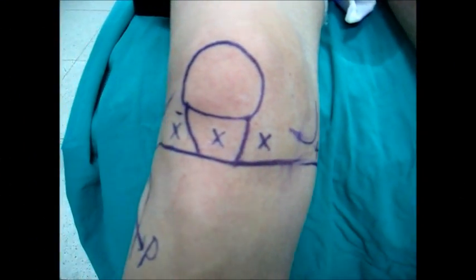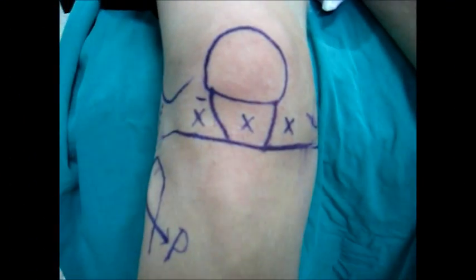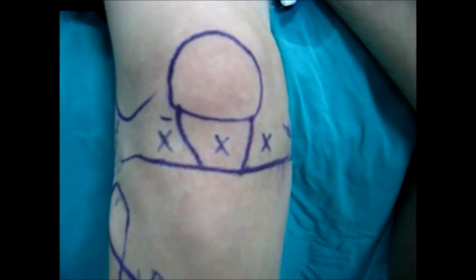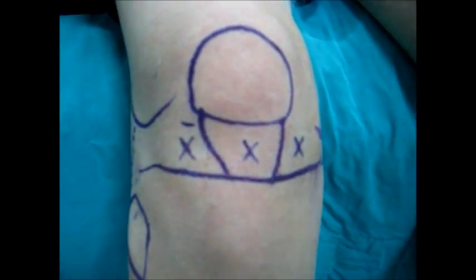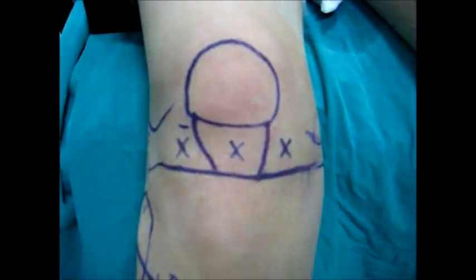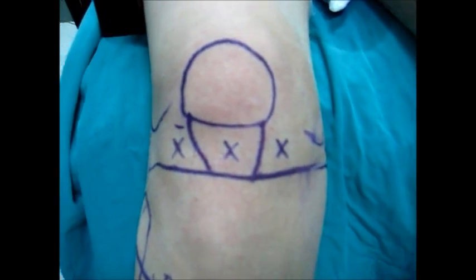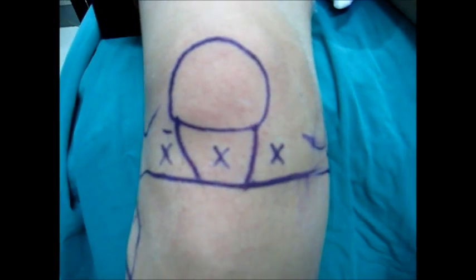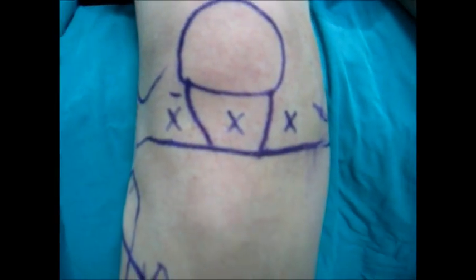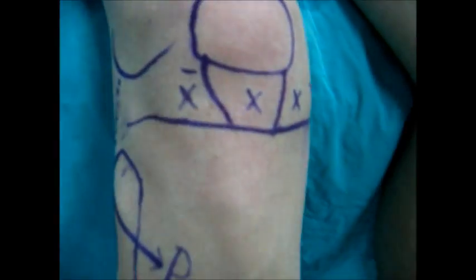These are the anatomical portals for knee arthroscopy. These are the most commonly used portals: the anterolateral, anteromedial, and transpatellar portals.